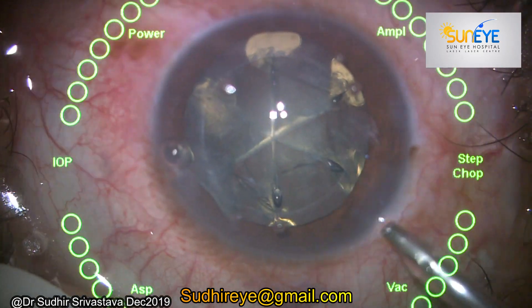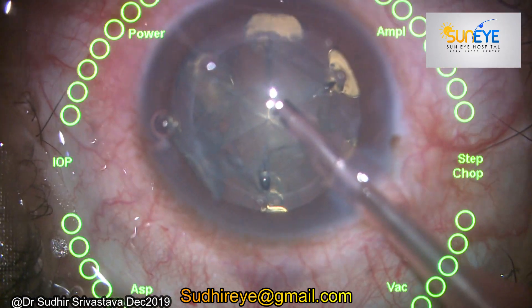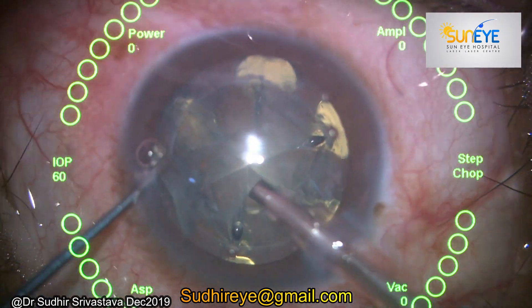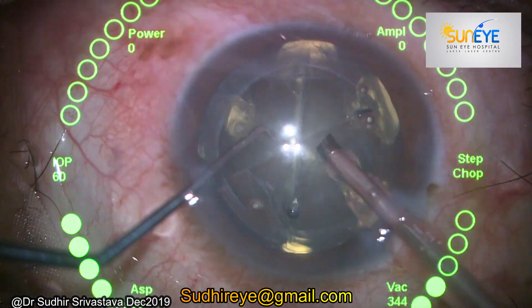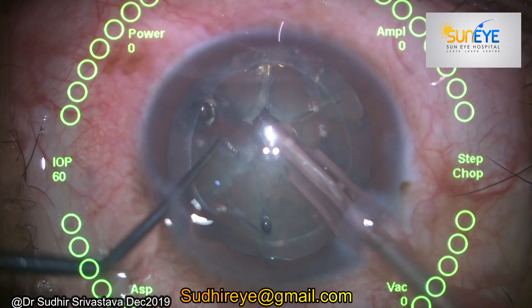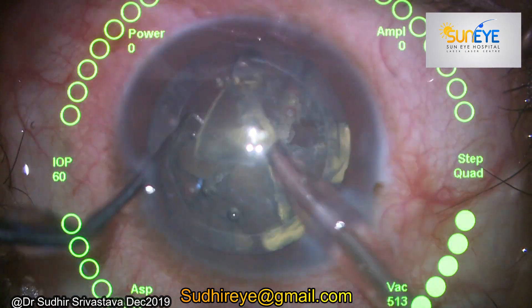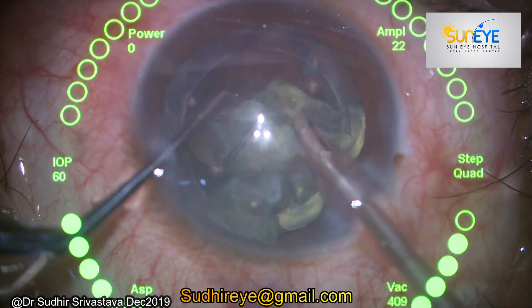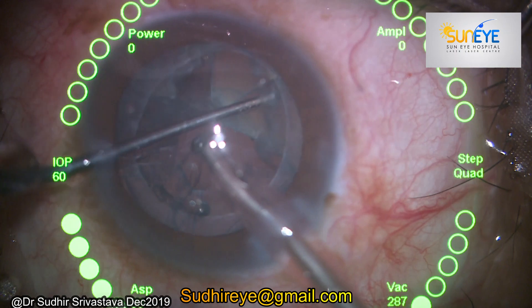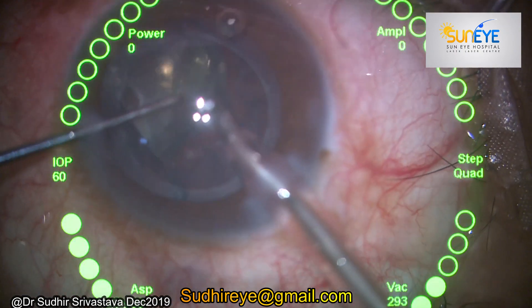I introduced my FECO tip because I have already divided the nucleus into six pieces with the help of FLACS. Now I'm just holding the pieces one by one, catching them and doing my fragmentation in the bag only. You can see that the pieces are loose and they are coming very easily to the tip, and very safely I completed my fragmentation within no time.